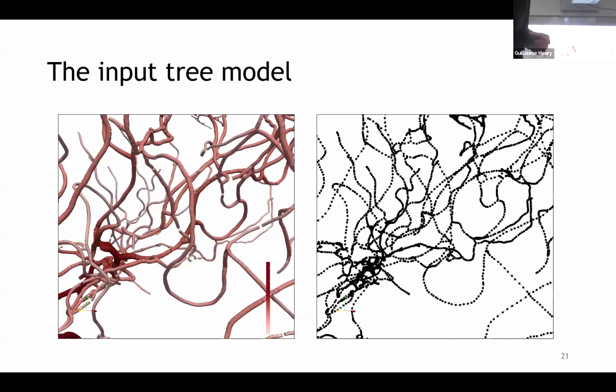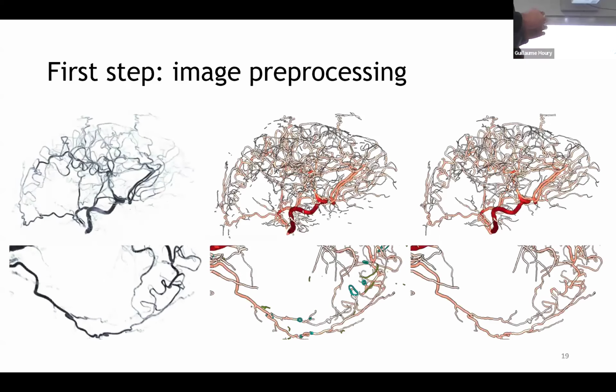And you can say that, to be clear, what is the picture that we're seeing? Because we are so used to it, yeah, that it's a left hemisphere. I don't know if you can see it. Of the carotid arteries. It's like this part of the brain. So like eyes are here, okay, to be clear, and that's this artery.